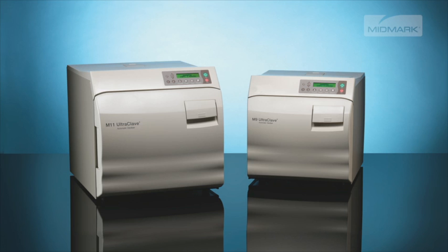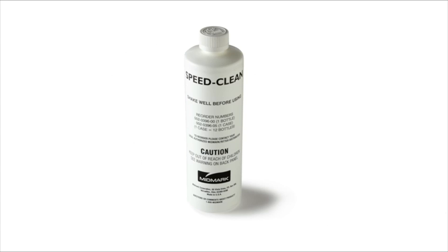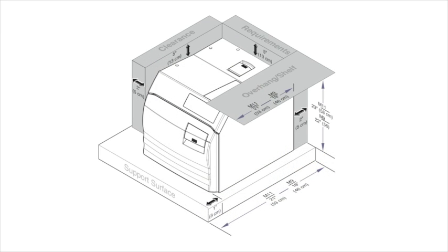Inside the autoclave you will find the M9-M11 installation and operation manual, a laminated quick reference guide for cleaning and operation, one bottle of SpeedClean, four trays, and a power cord.